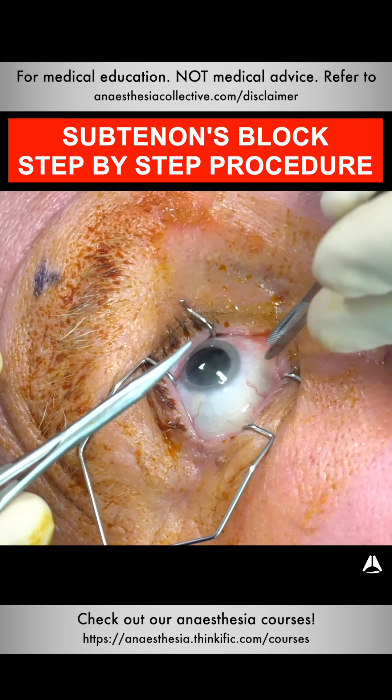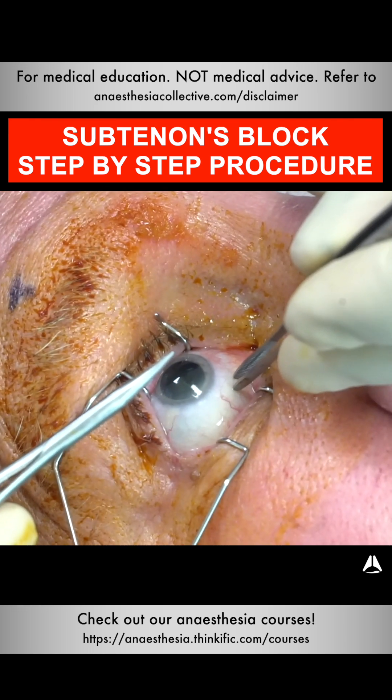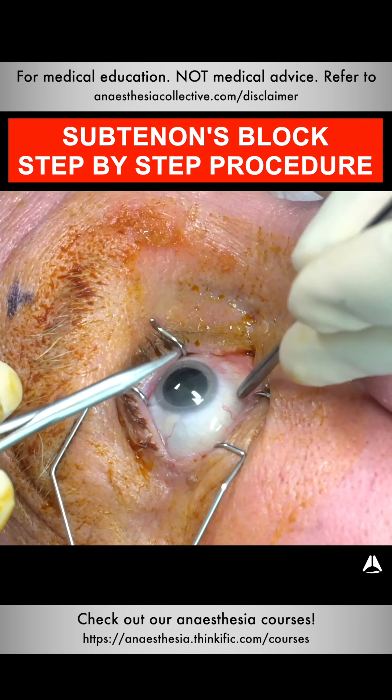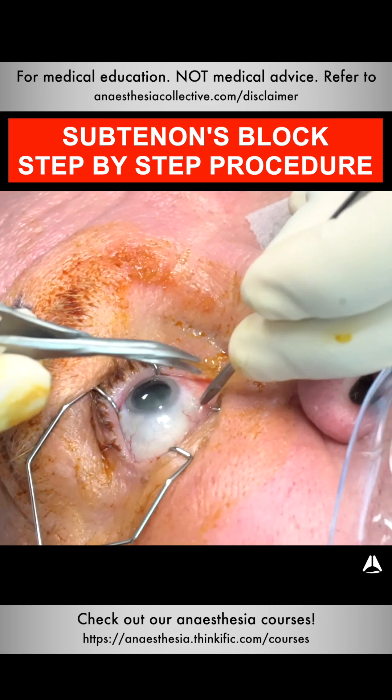Picking up of the conjunctiva is about seven millimeters from the edge of the iris. I'm in the inframedial quadrant. I press down and then lift up. I then use these scissors to go down onto the eyeball and make a small incision.